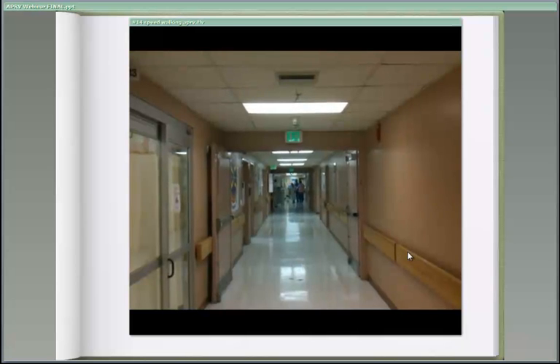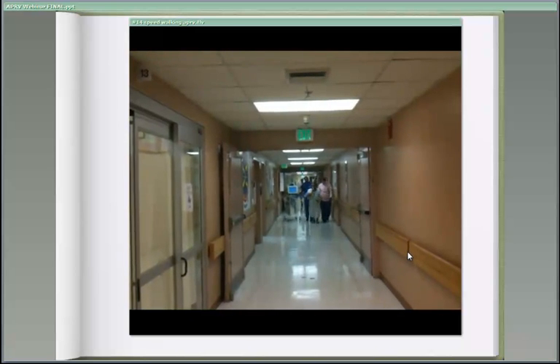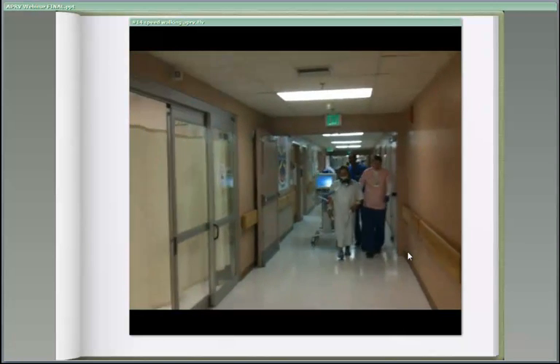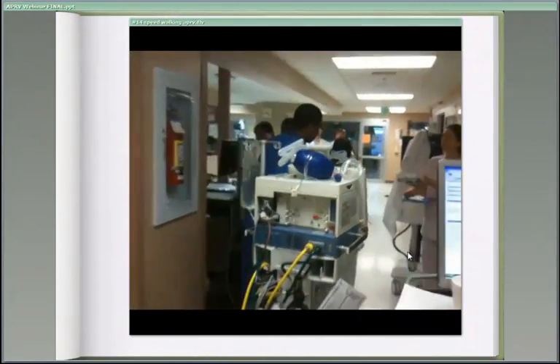Now, just very quickly, some of our patients have taken this to a bit of an extreme, and in fact, one of our patients, which I'll show you here, in a moment. Now, this particular patient, also a trauma patient, who you'll see here in a minute coming up in the hallway, was doing several laps around our 24-bed unit. So walking around, and actually quite vigorously, to the point where it was very difficult to keep up with this particular patient. And again, all patients are generally comfortable on APRV, certainly don't necessarily need zero sedation, but certainly need a significantly reduced amount of sedation. And again, I think a lot of this has to do with the specific methodology, which I will elaborate on as we go further into this.